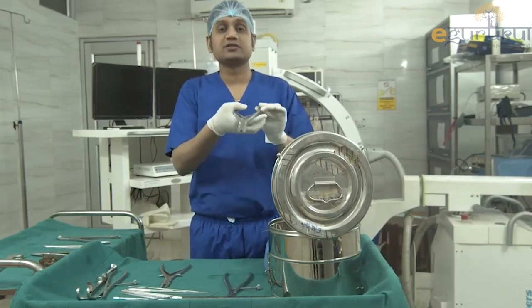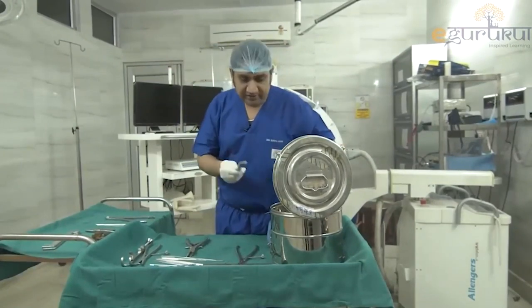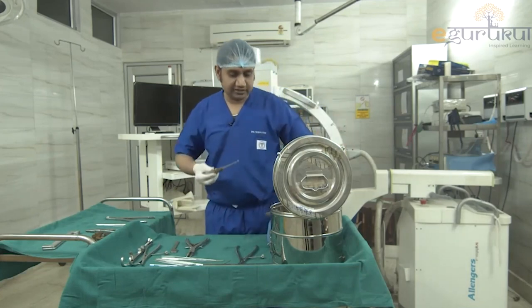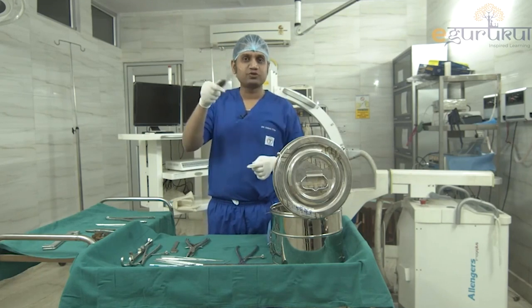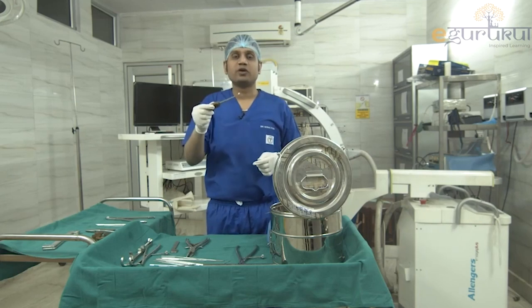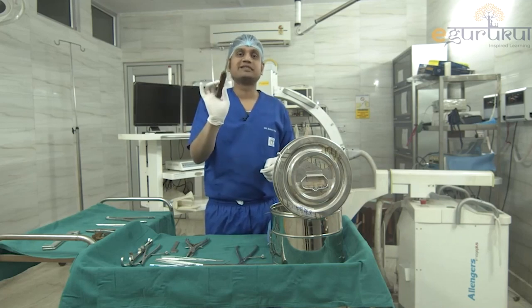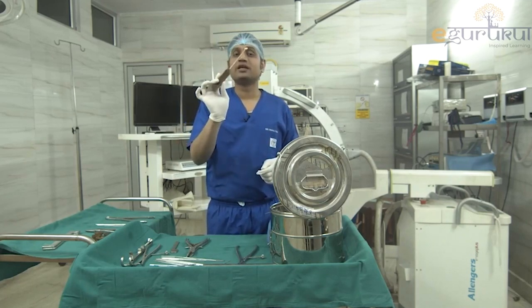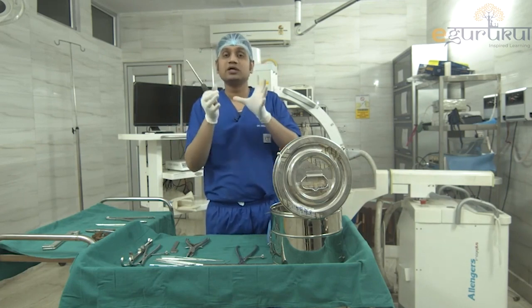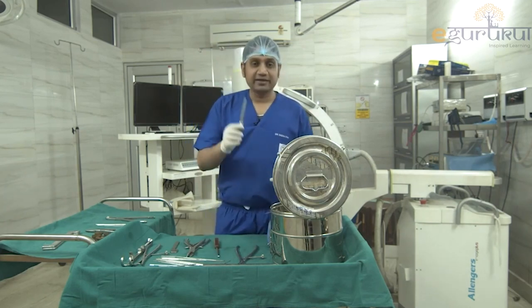There is also a small-size bone nibbler and a small plate bender. Then we have the bone scoop — like an ice cream scoop — used to take out bone graft from inside the bone, such as from femoral condyles or the iliac crest. It is used for curettage of bone for grafting purposes.